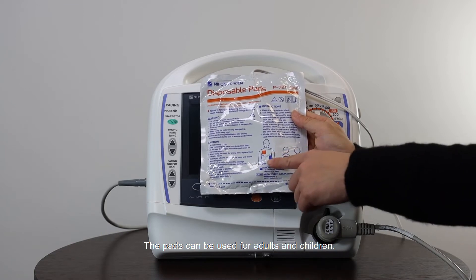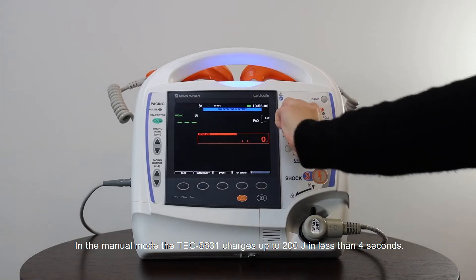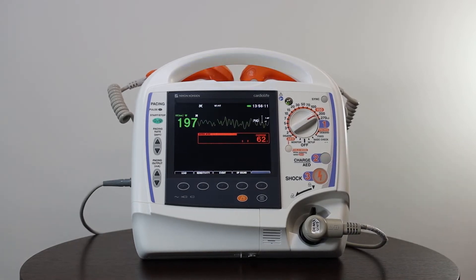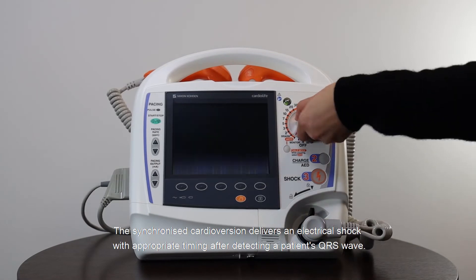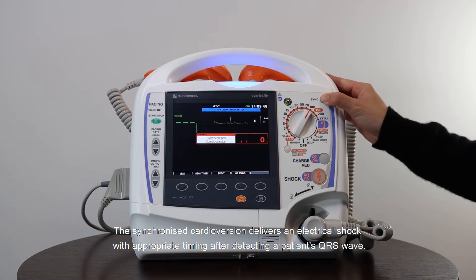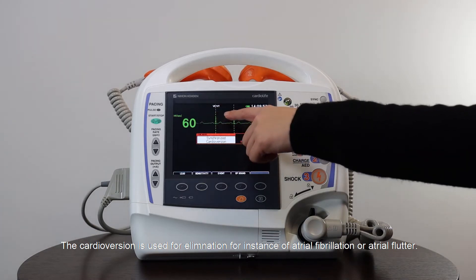The clear wave technology of the pads ensures that chest compressions are filtered out. The pads can be used for adults and children. In manual mode, the TEC5631 charges up to 200 joules in less than 4 seconds. The synchronized cardioversion delivers an electrical shock with appropriate timing after detecting a patient's QRS wave, and is used for elimination of, for instance, atrial fibrillation or atrial flutter.